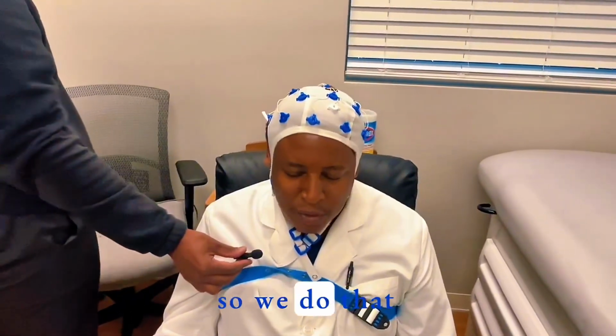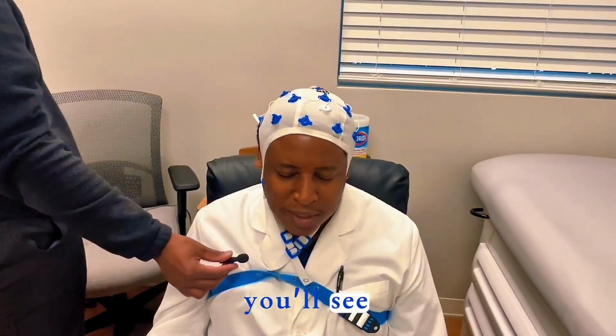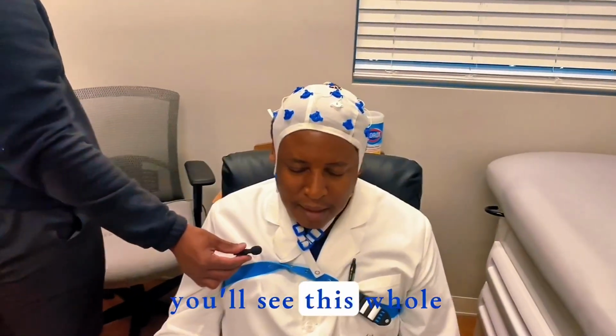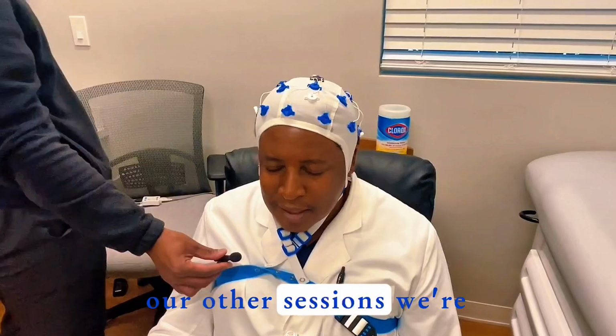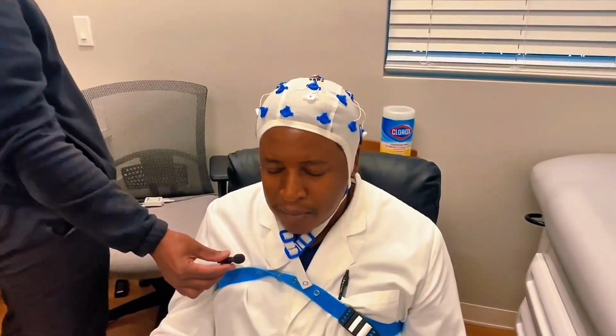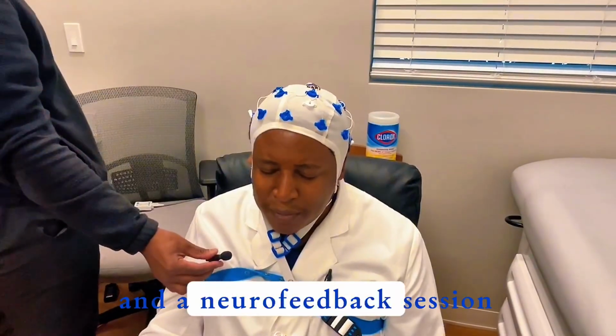So we do that here at the Brain Spine Pain Institute, and excited to take you through the journey. You'll see this whole EEG data gathering process, and in one of our other sessions, we're going to show you the TMS process, the transcranial magnetic stimulation process, and the neurofeedback session as well.